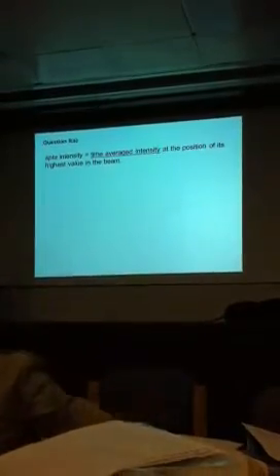Yeah? It says in the notes that the beam axis doesn't necessarily locate the focus. Well, that's where it's a perfectly ideal system, particularly if you're talking about phased arrays. The actual pulse profile is a lot more complicated. They're not perfectly circular. It's going to be a challenge. And it also depends on the tissue you're covering.